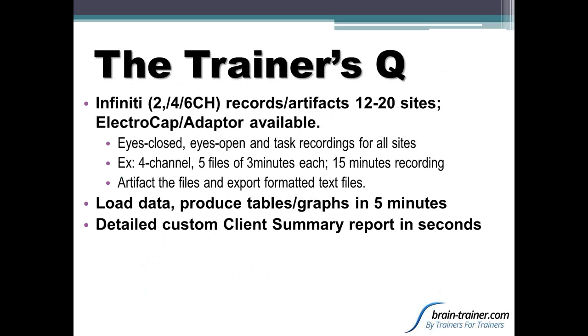The cap doesn't shift. You don't have to worry about electrodes moving or falling off or anything like that. That's all done in the beginning, usually 5 or 6 minutes, and then you literally move through the groups of 5 4-channel packages or whatever you're using.